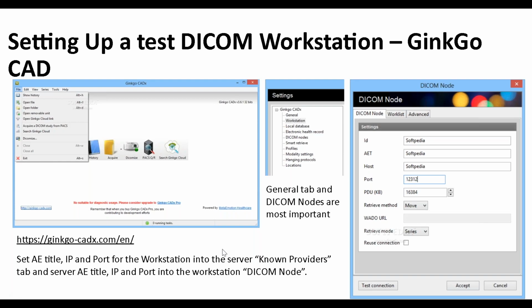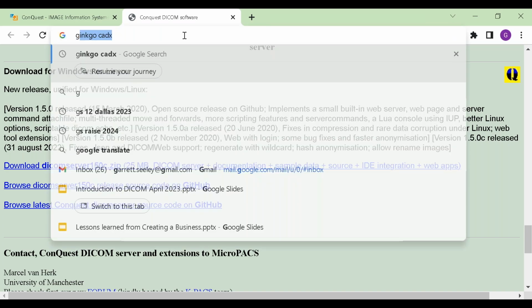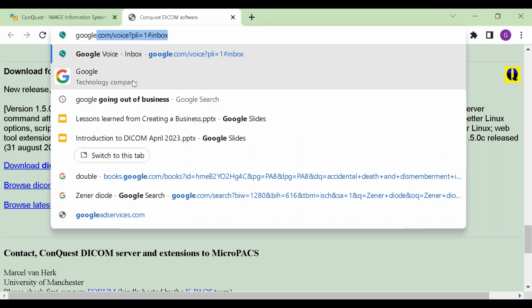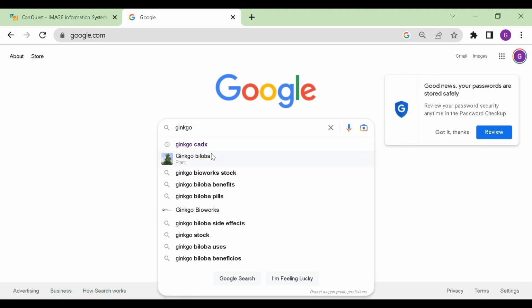Plus, unlike the zip file that you have to unpack into a specific folder, Ginkgo comes with an MSI, a Microsoft installer. You can just download it and run it. So it installs just like your web browser would, or any other piece of software that you might get over the internet. So let's take a look at that. I guess I'll start at Google just to make sure that everyone's familiar. This is where you'd normally start, right? I'm going to put Ginkgo, and yeah, not Ginkgo biloba, Ginkgo CADX.